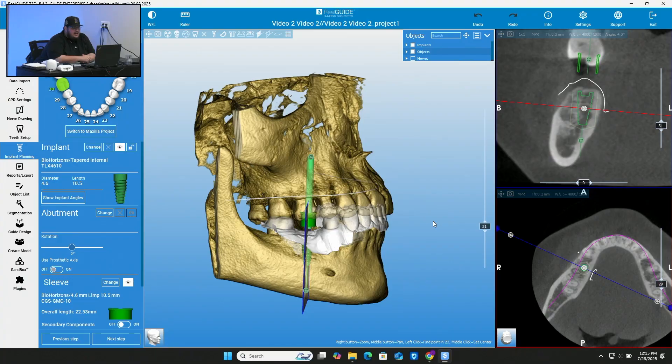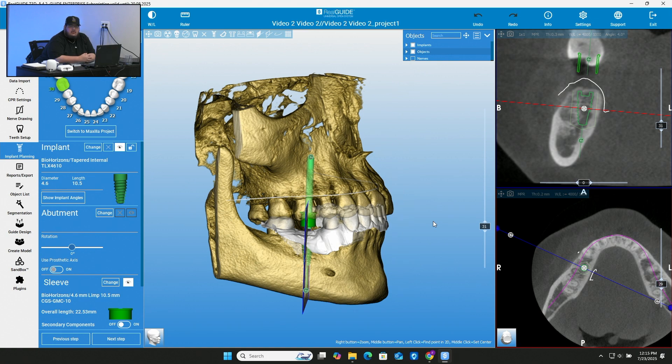So right now I have this case up. I did a single implant planning for tooth number 30. I used a BioHorizon implant. So what we're going to do right now is we're pretty much just going to make an implant model that you can print out in your office or in your laboratory using a 3D printer to be able to fit any type of crown that you want.